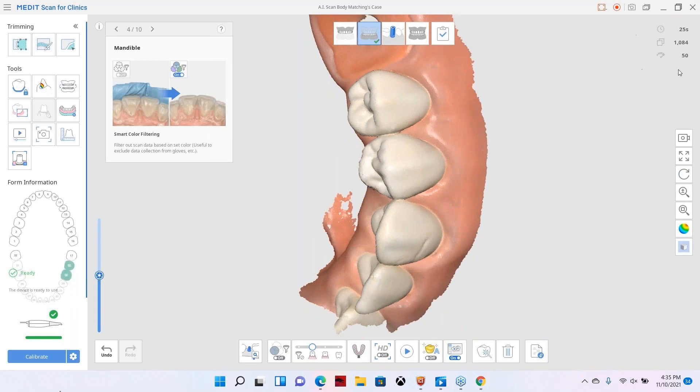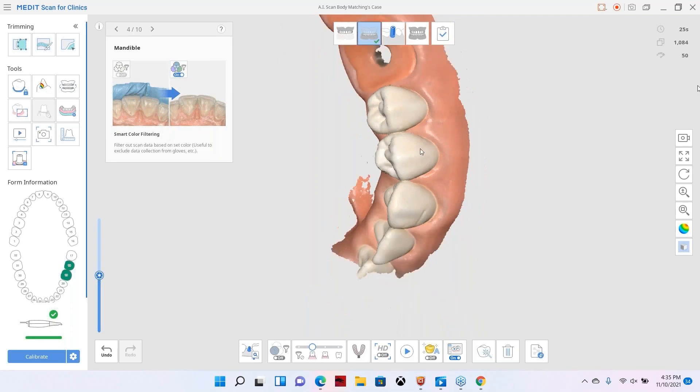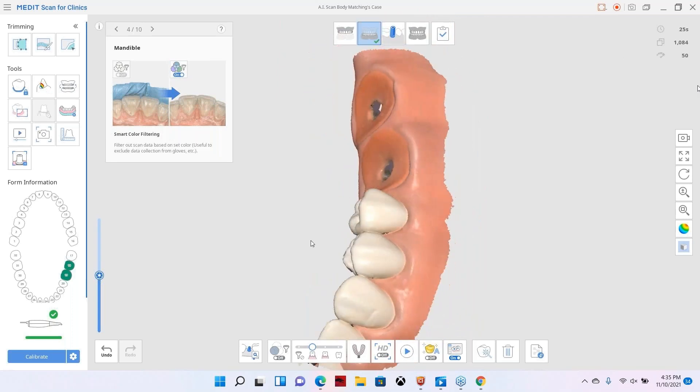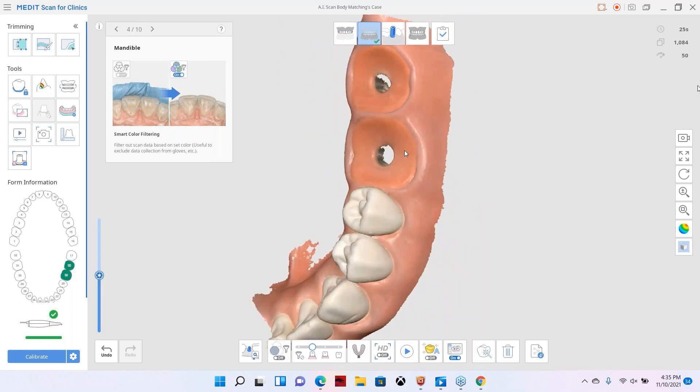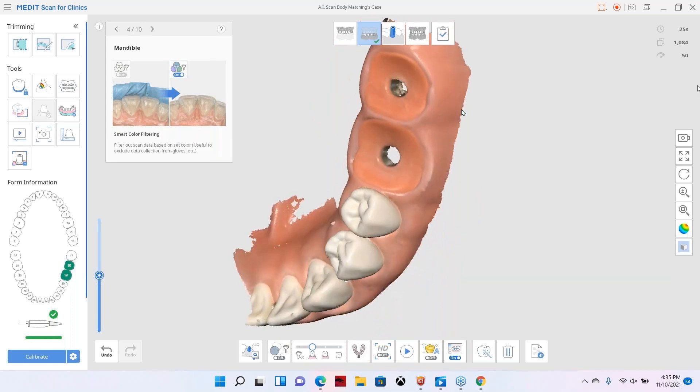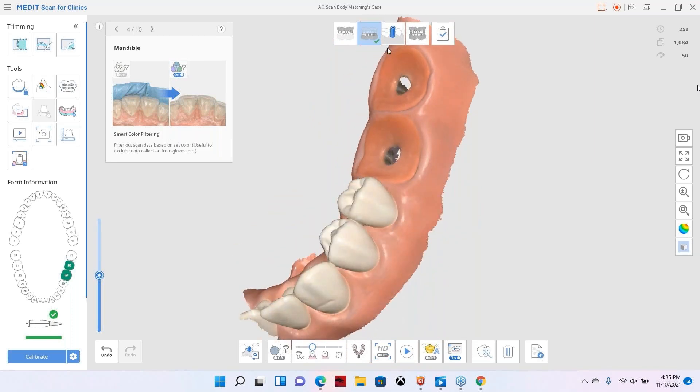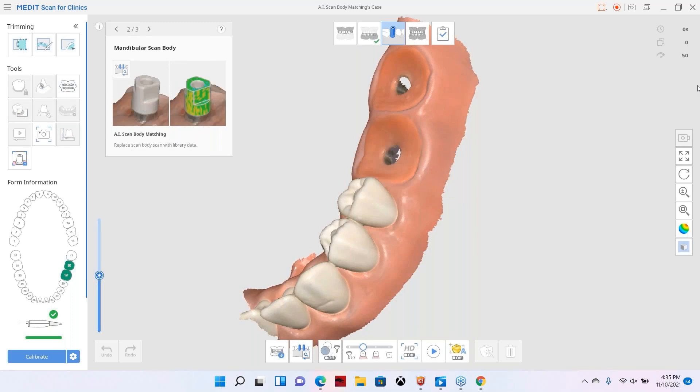If you go into the upper right-hand corner, you can view your scans time, your speed. We were at 50 frames per second. You can obviously go up to 70 with the i700, which is really cool. So you can really increase your scan time there. As you guys know, when scanning scan bodies for implants, you want to scan that soft tissue so you can get that emergence profile. Our next step will be to move on to scanning the scan bodies. And here's where you're going to see those updates.